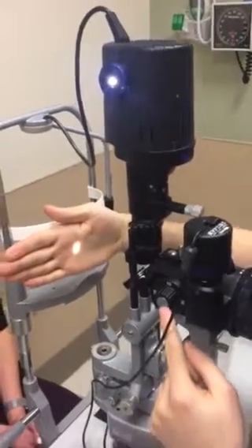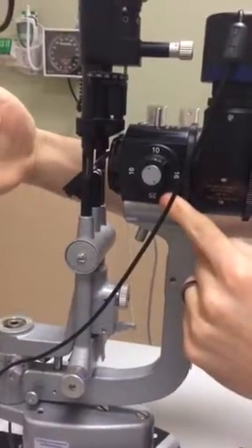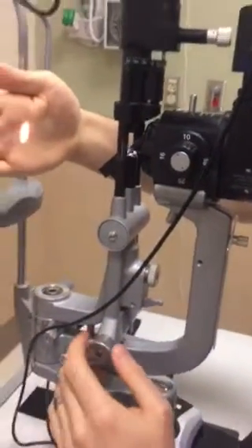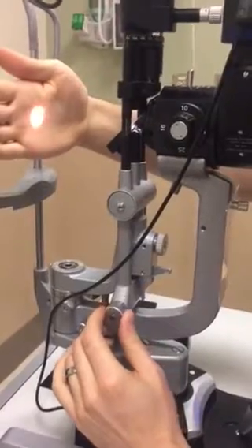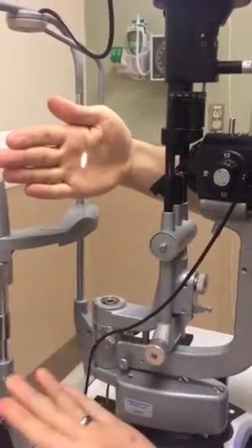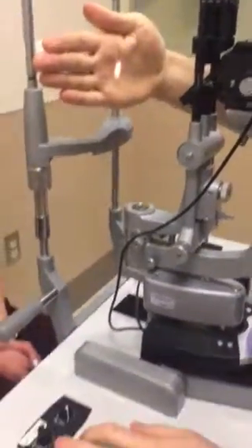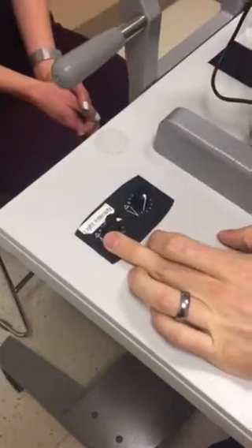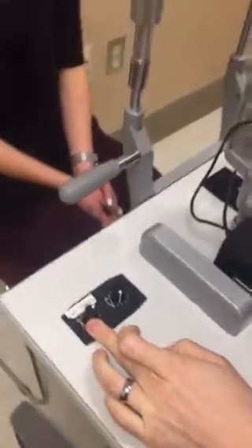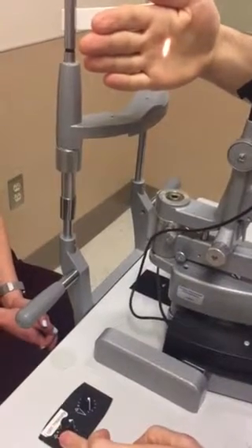Moving down, we have the magnification selector — you have 10, 16, and 25. It's most appropriate to start at 10. Moving down further, this controls the width of your beam: opening it up makes the beam wider, closing it makes it narrower — generally I have the beam narrower when I start. Additionally, you have the light intensity control down here. Somewhere in the middle is about right. When examining photophobic patients, turn the intensity down; when looking for anterior chamber cell and flare, turn the intensity all the way up.